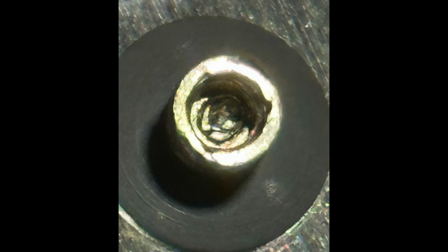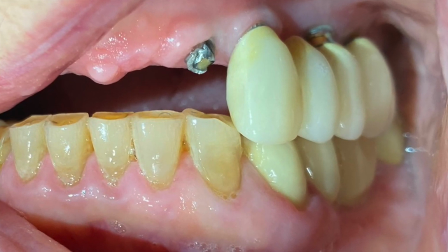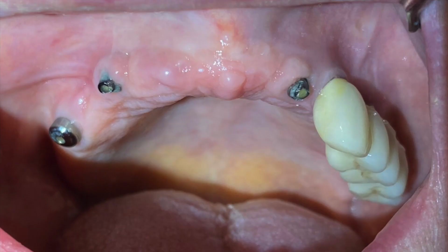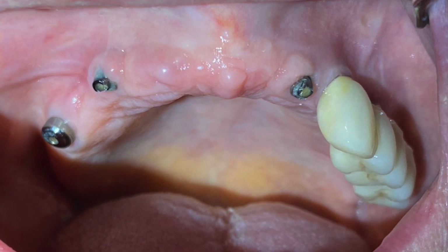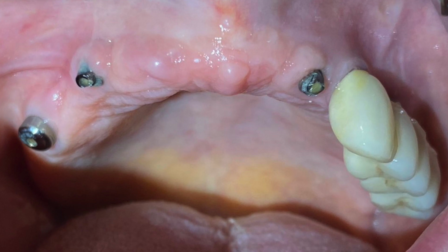And let's not forget the next issue, which is that an abutment fracture usually doesn't come alone. The abutment screw breaks also, and it's usually a multiple fracture issue. Unfortunately, things don't stop here. And if the fracture of the abutment doesn't happen, well, that force has to go somewhere. Where does it go? To the bone. So what happens next is that we start seeing crestal bone loss.